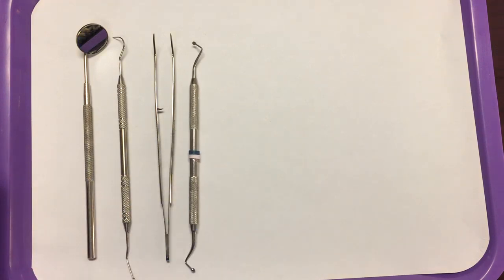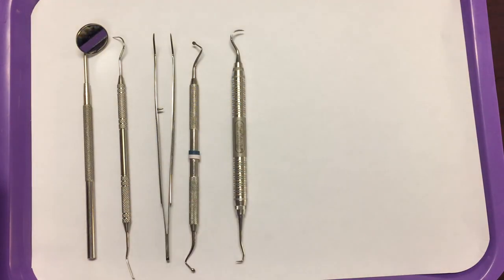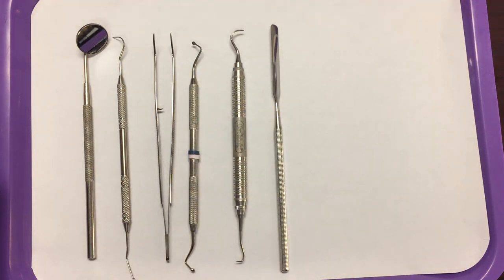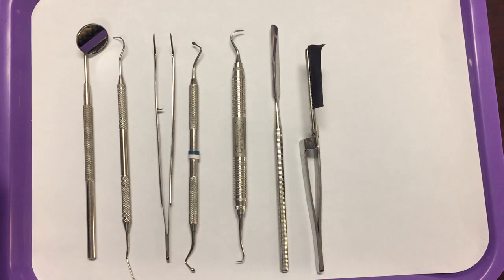On this tray setup, the spoon excavator may be used to help spread the cement around on the inside of the restoration. You will still need your scaler, which will be helpful to remove dried cement from around the restoration, your cement spatula to mix your cements, and your articulating paper and holder to check the bite.